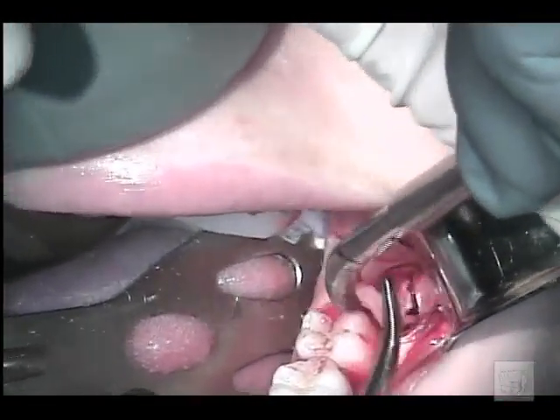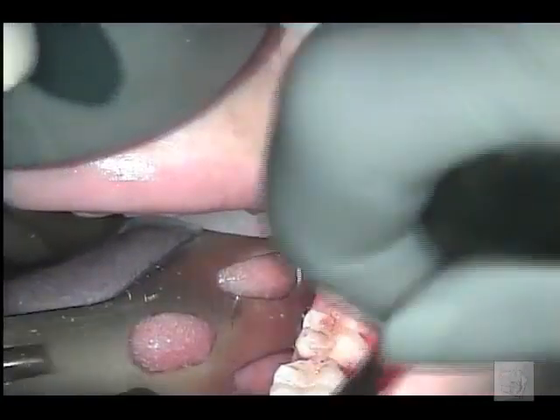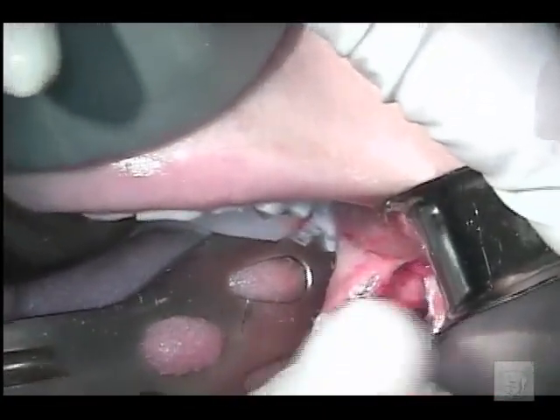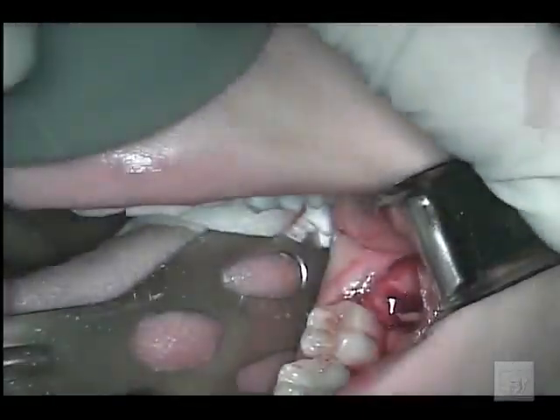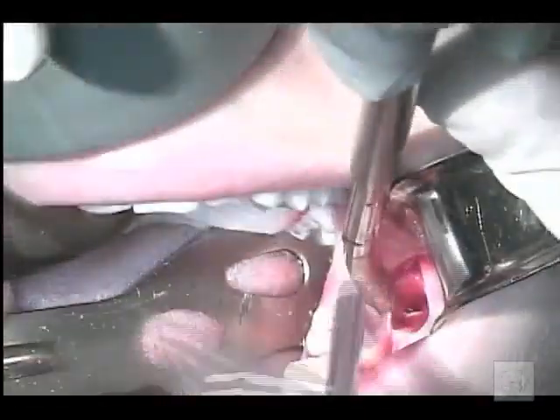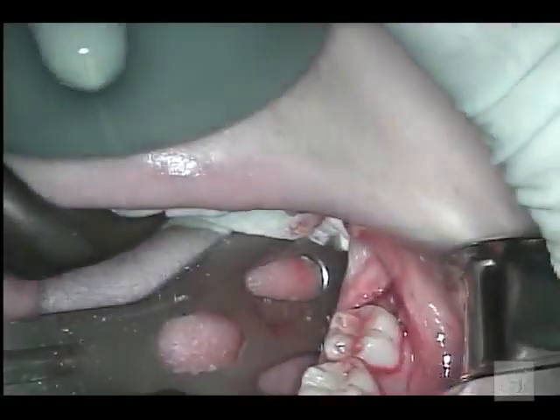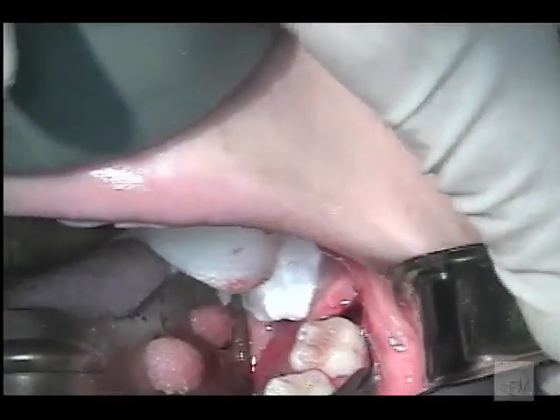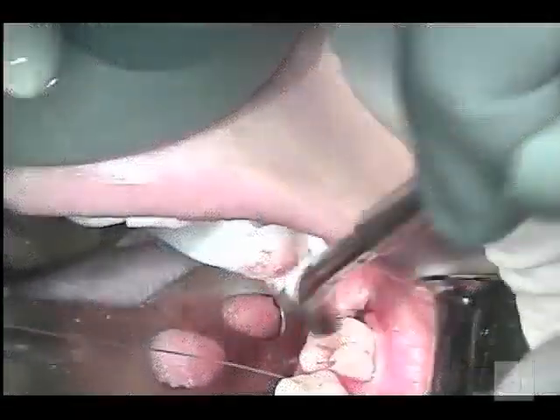Once you've removed all the soft tissue, you go back with a bone file and smooth off the bony edges so that they're not sharp and there's no little bony splinters. You then irrigate the area, flush it out real well, and then you can go ahead and close. And I put a single stitch between the first and second molar, and go ahead and tie that.